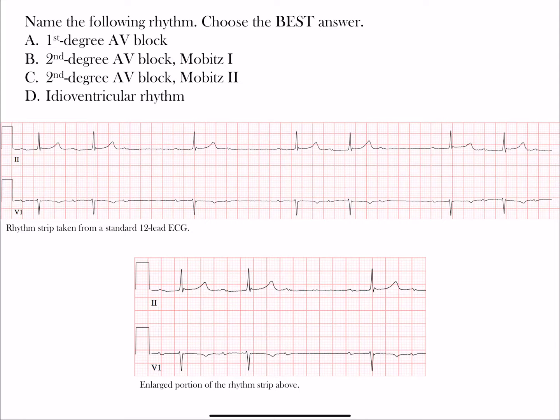To reorient yourself, we have two leads present here: Lead 2 and Lead V1. Lead 2 is an inferior limb lead and V1 is a right precordial lead. These are normally the best leads to get a good view of those P waves.